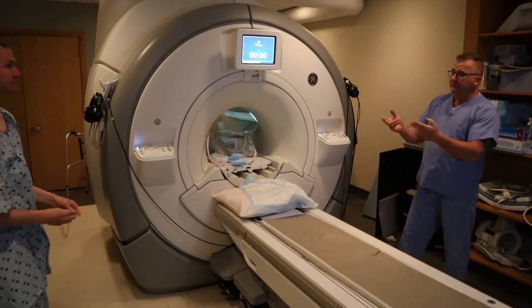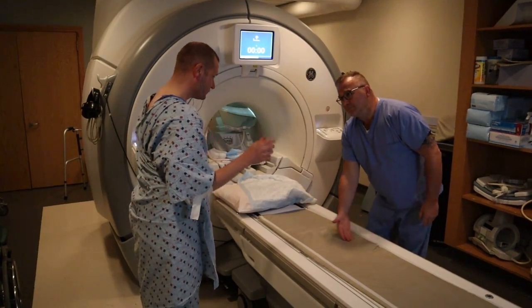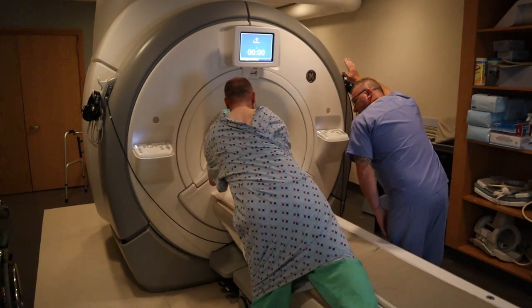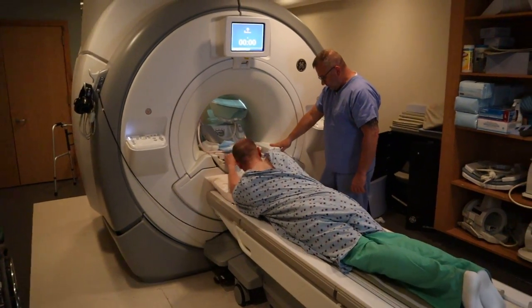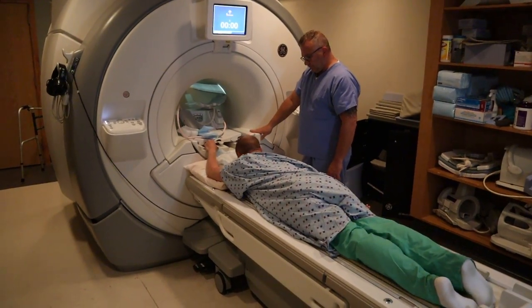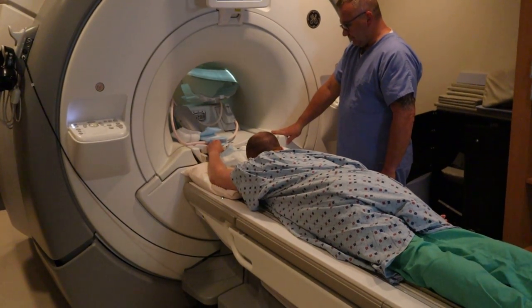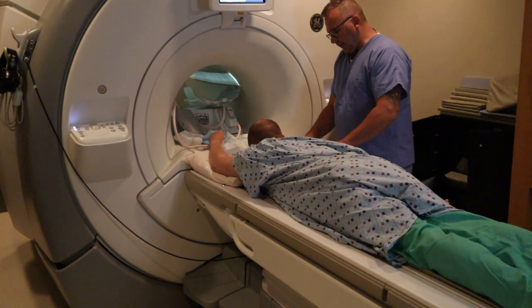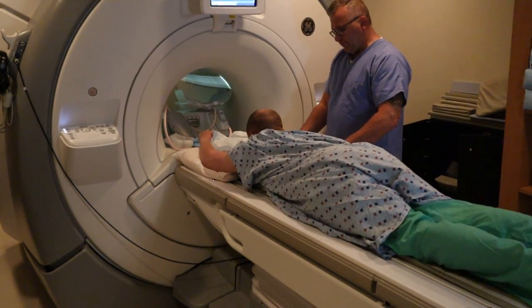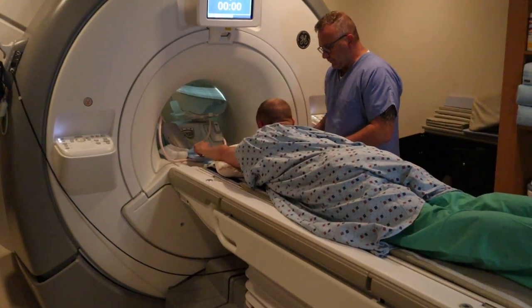We're now going to position for an MRI of the elbow. Similar to the wrist, you want to have the patient put their earplugs in before they get positioned. The patient is going to be prone with their arm outstretched. If you're doing the left elbow, you want to offset the patient to the right, so that you get that elbow in the middle of the B0 tunnel.